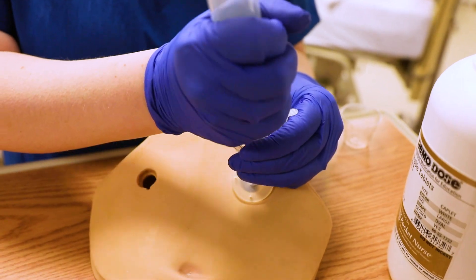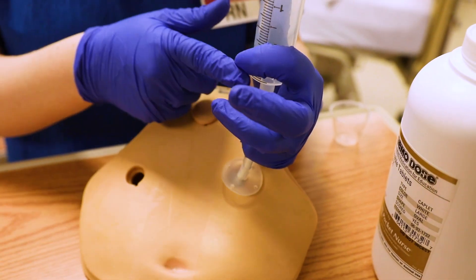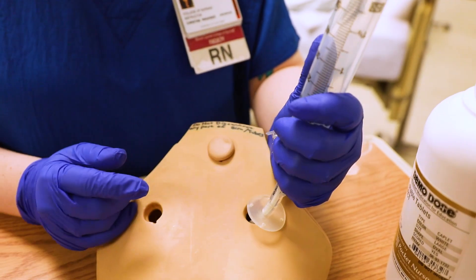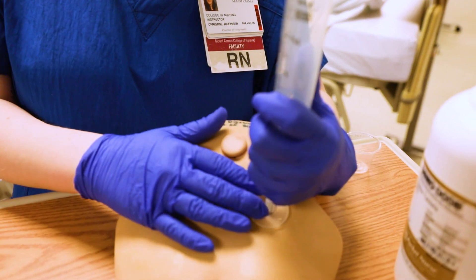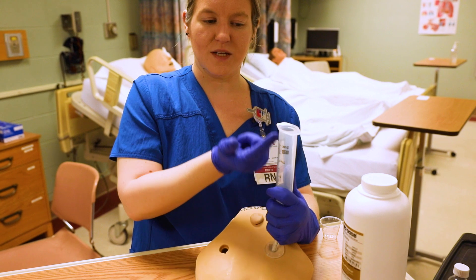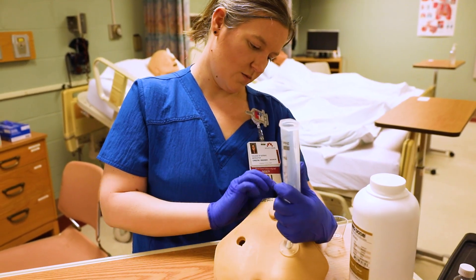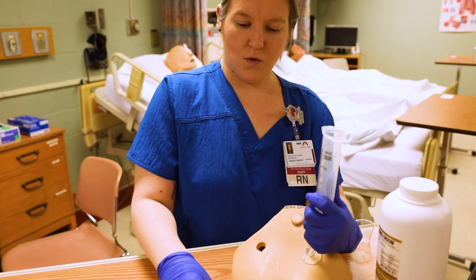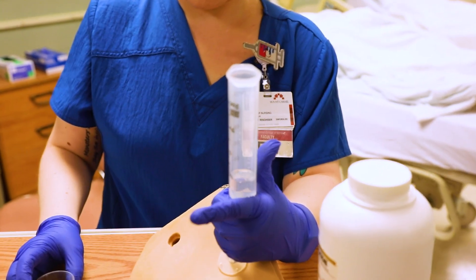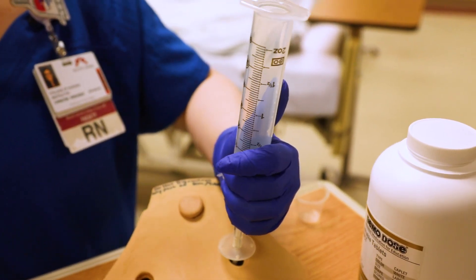I'm going to connect the syringe. I like to hold with my pinky on the tube, and with my first finger, middle finger, or thumb I hold the syringe, with the other fingers stabilizing in the middle. If your patient starts to cough, be ready to put your hand on top because things can come flying out. Make sure the tubing is open, then flush — you can see the fluid going down. There's 20 ml's.